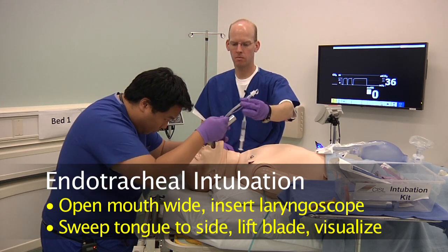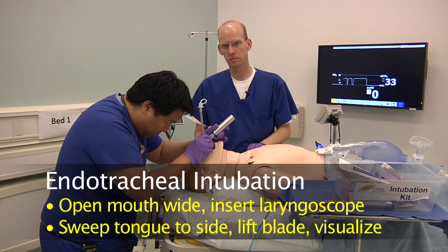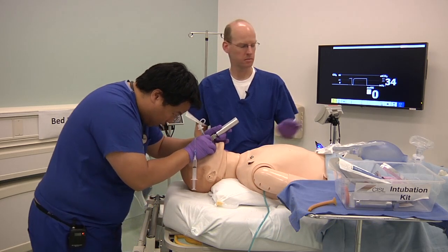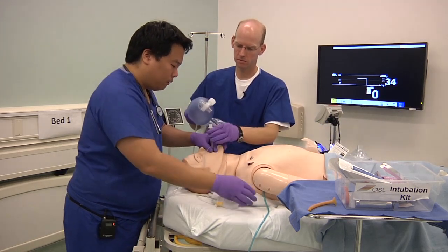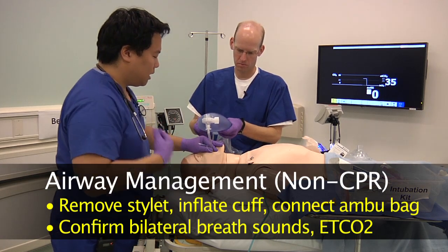I have a grade 1 view. And when you have the grade 1 view, don't look up to see where the tube is. Someone will hand it to you. And keep that visualization on the glottic opening. And then once the endotracheal tube is in place and the cuff is past the cords, then you can now remove the stylet. You can inflate the cuff, and you can have an assistant ventilate the lungs.